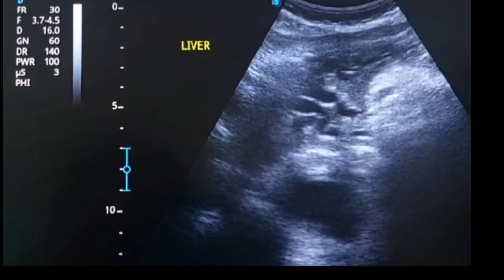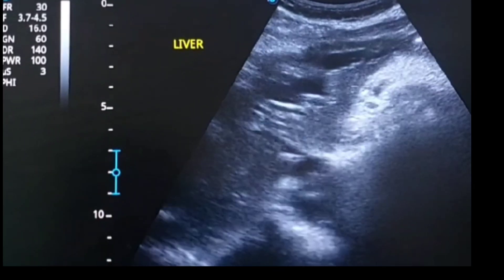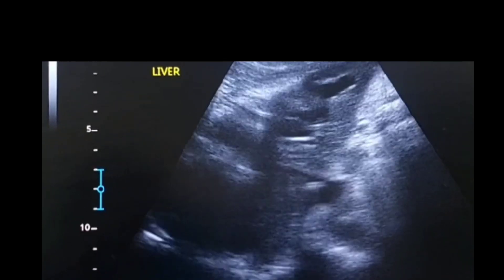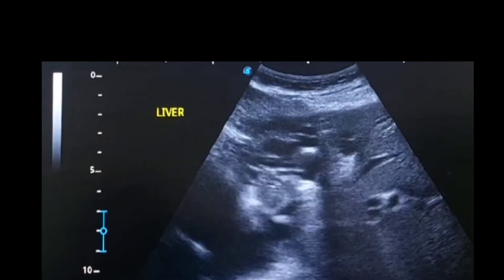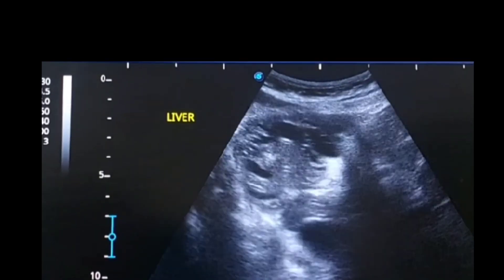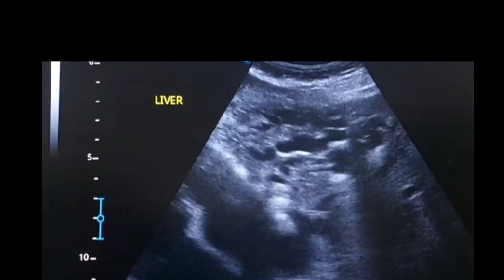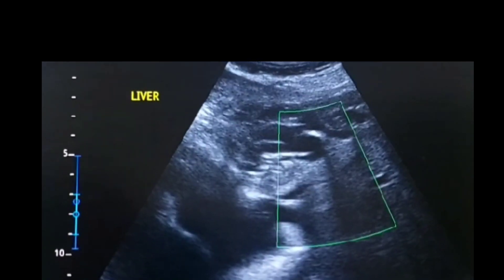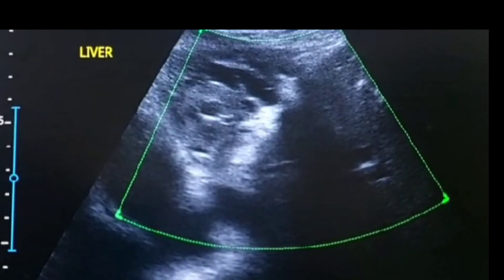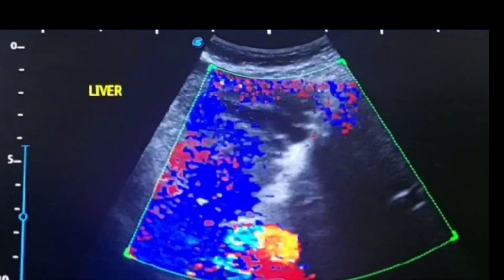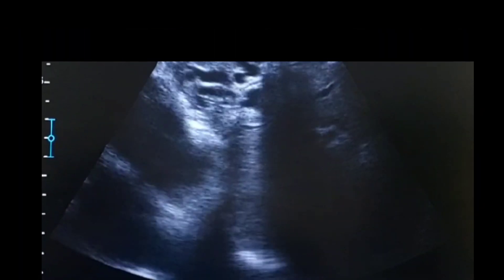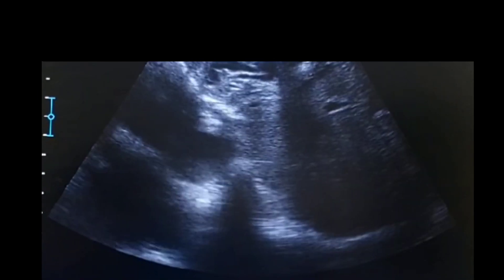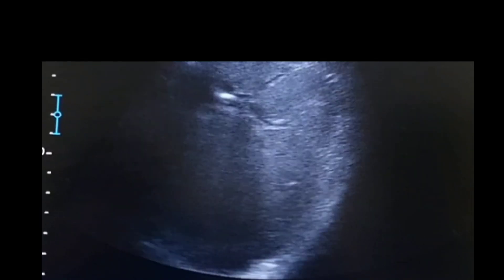You have to change the probe to confirm whether this is the right or left lobe — but this is the left lobe as visible on this image. You should also survey all the liver and look for any mass compressing the proximal biliary channels supplying the left lobe. You should apply Doppler signals to confirm differentiation between biliary channels and vascular channels. Here it is confirmed as purely biliary channel dilatation with no vascular involvement.